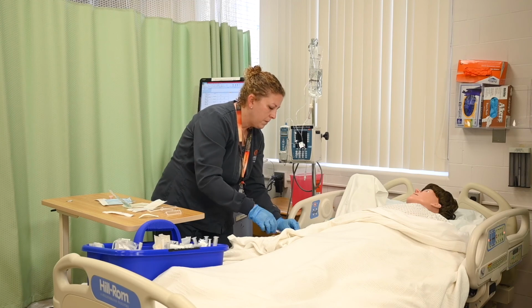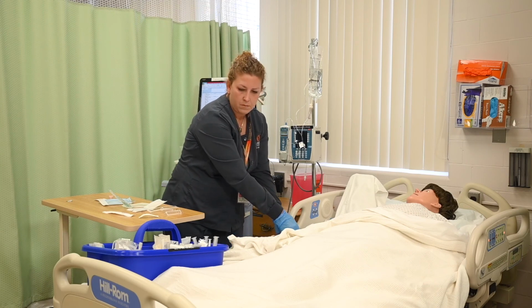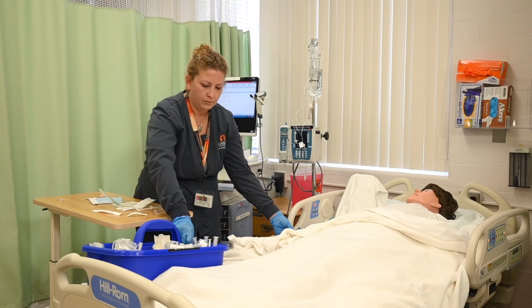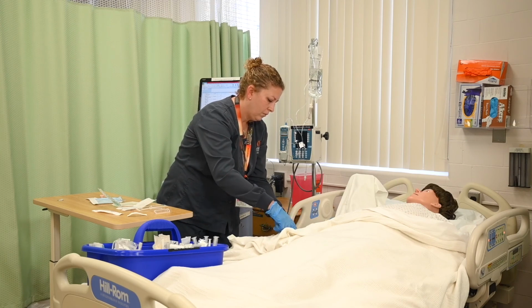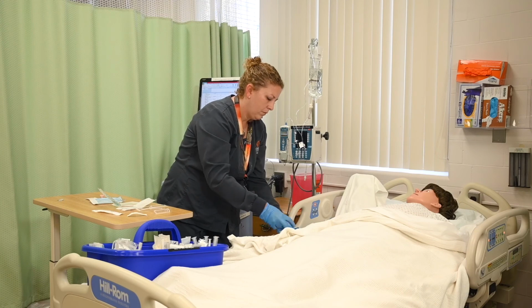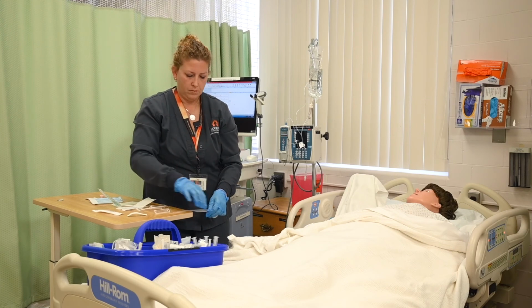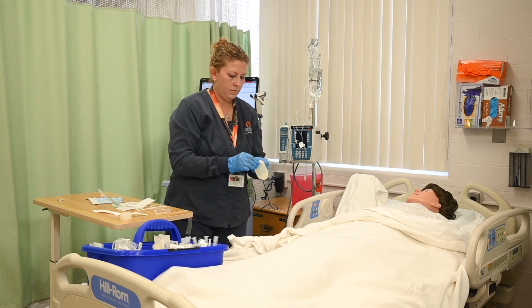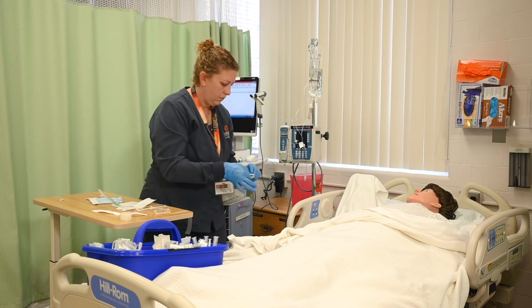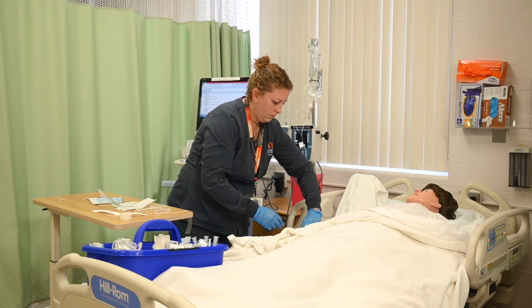Remove the 2x2 gauze dressing and clean around the site without contamination. Apply tape to the extension set, or INT, to stabilize the catheter. You may now let go of the catheter. Apply a transparent dressing over the insertion site, maintaining sterility of the site. Be sure to cover the hub of the IV catheter, but not the extension set.